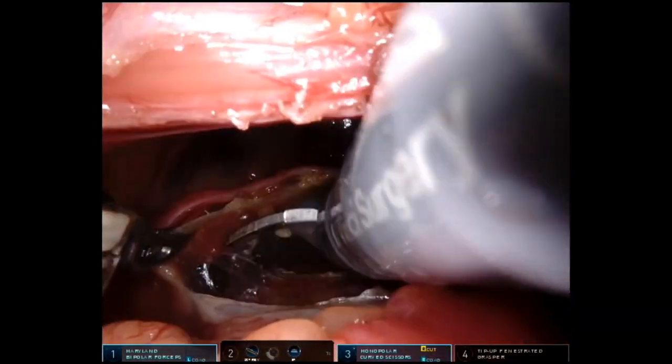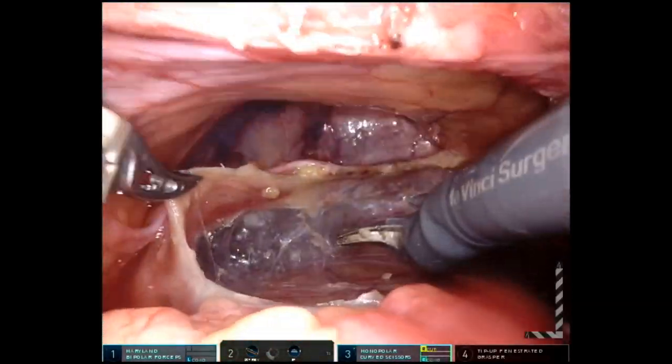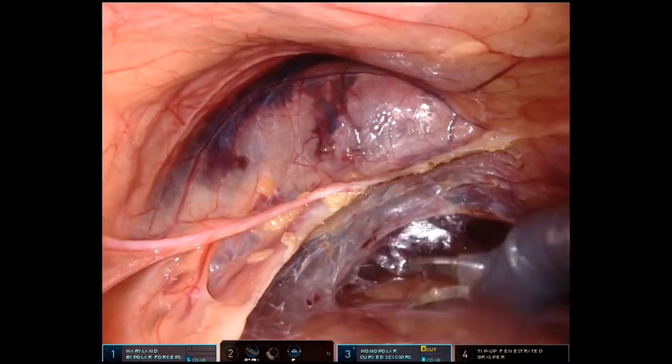This is further mobilization of that hernia sac, way up into the chest. This patient had a fairly large hernia — the CT scan preoperatively showed around 65 to 75 percent of the stomach was actually in the chest.